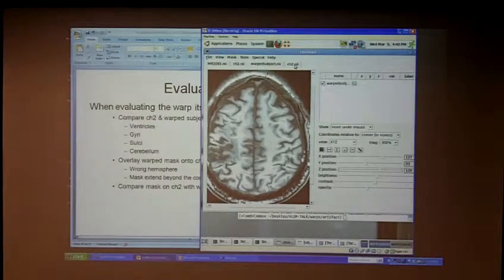It doesn't have to be, but that would be a sensible way to use it. Take the discrepancy map, basically all the voxels that are in this lesion but not that one, and vice versa, divide them up into contiguous segments, fragments I call them, and then present them to a rater one at a time in random order, and ask if you think this is part of the lesion or not.